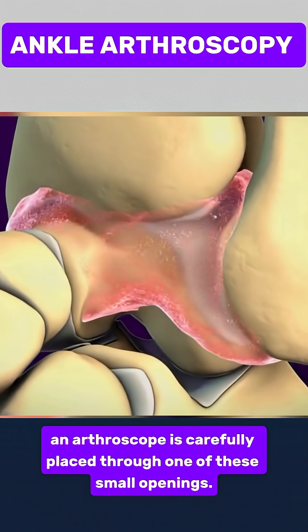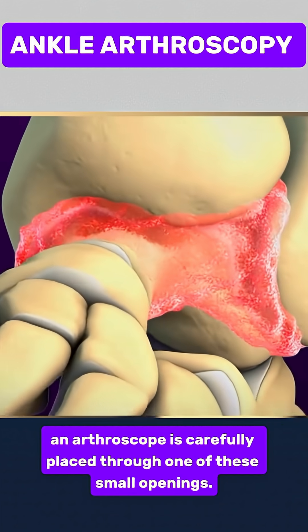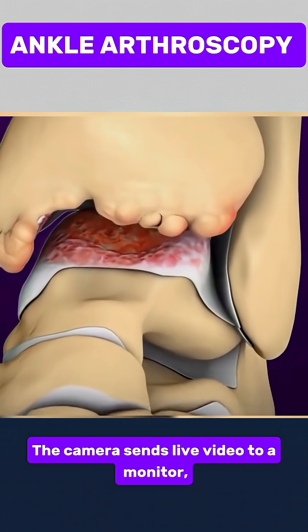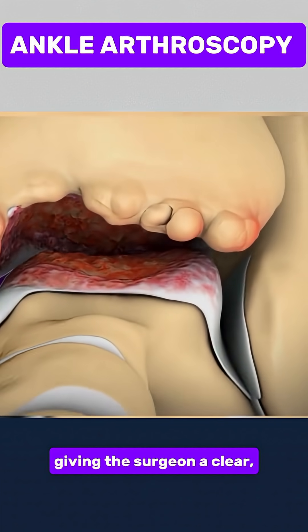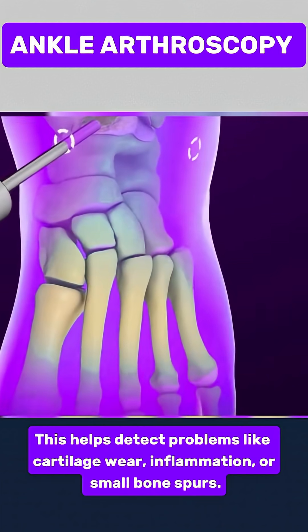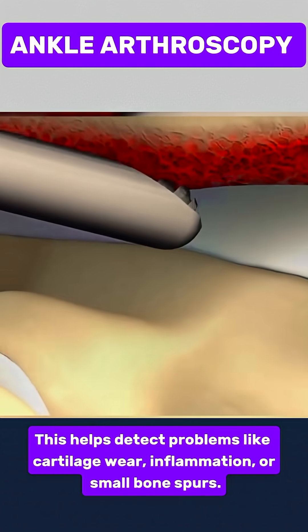Next, a slim camera called an arthroscope is carefully placed through one of these small openings. The camera sends live video to a monitor, giving the surgeon a clear, magnified view inside the ankle joint. This helps detect problems like cartilage wear, inflammation, or small bone spurs.